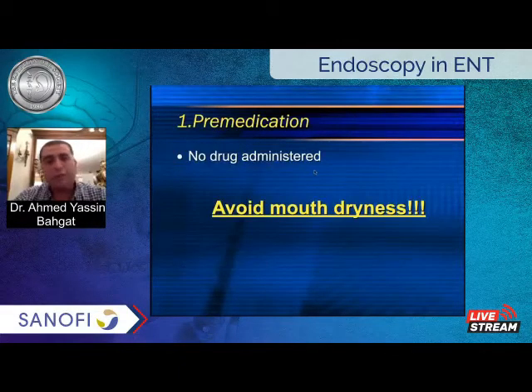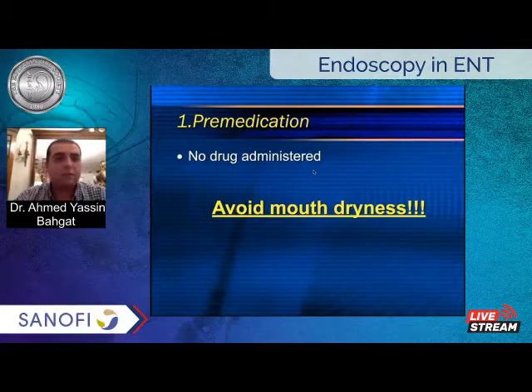Pre-medication: we don't give any pre-medication to the patient. No drugs. Don't give atropine. Don't give any drug before doing sleep endoscopy. Take the patient to the OR, and the first thing you give is propofol.